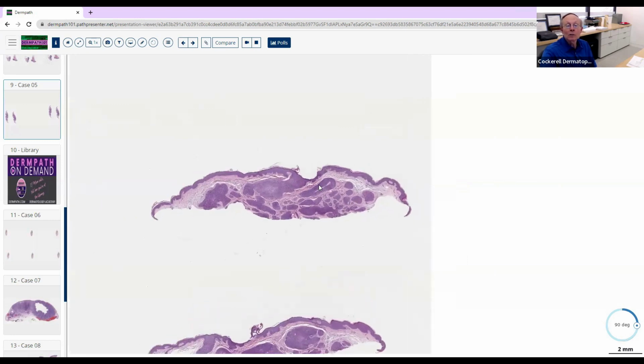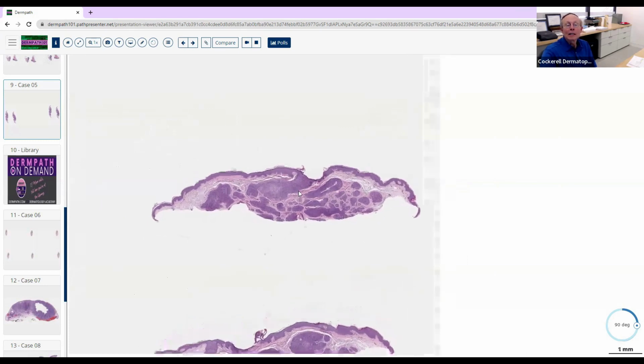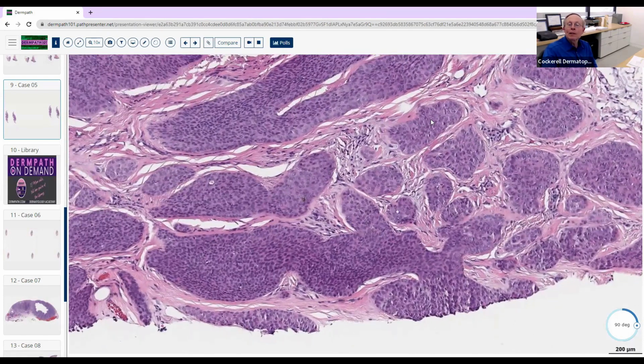We don't know how deep it goes, but it seems to be a small lesion that's well circumscribed and symmetrical. So it's got those features of benign. I agree with you. What about differentiation? Epithelial or non-epithelial? I had a difficult time at first, but I think it's epithelial. Okay, now what do you use to tell epithelial from non-epithelial?